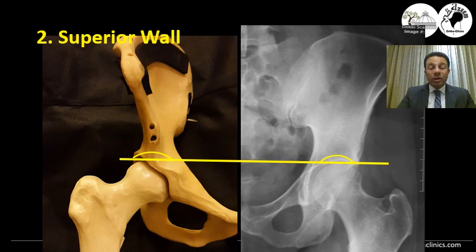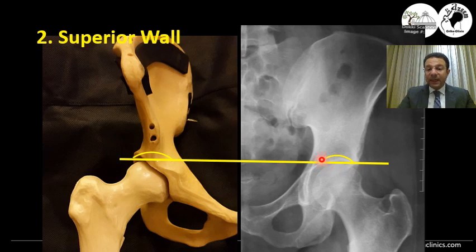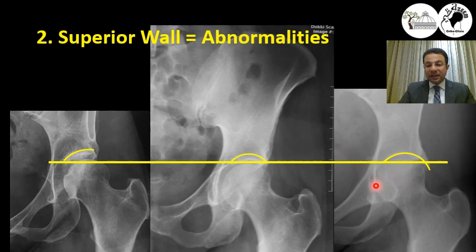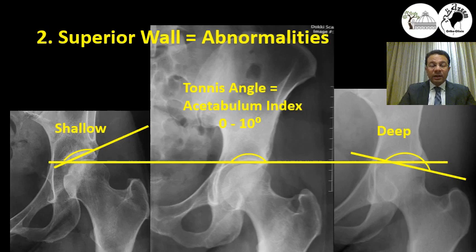The superior wall, or the dome, or the superior covering part of the acetabulum, corresponds to a radiographic line that starts and ends on the same level. This sclerotic area covering the head should start and end at two points on the same level. If you have a shallow acetabulum, it will end in what we name a positive angle. If you have over-coverage or a head deep inside the socket, the acetabulum will be covering more of the head and it would end in a negative point. This is measured using a tonnis angle, or acetabular index. The normal acetabular index ranges from 0 up to 10 degrees positive.